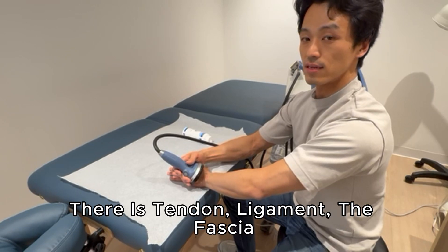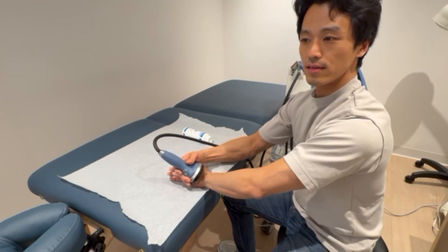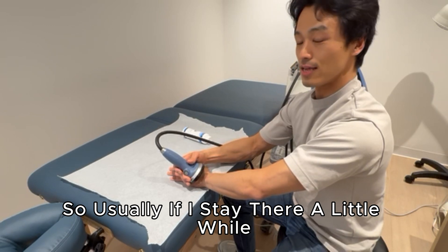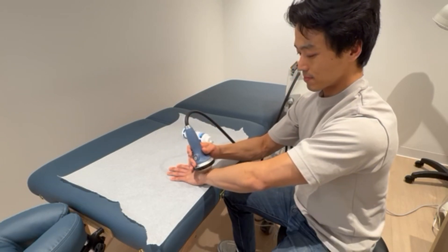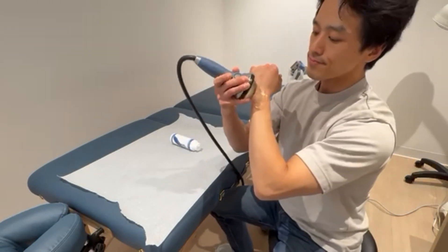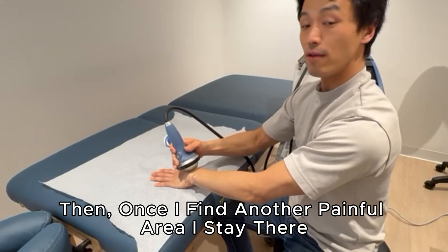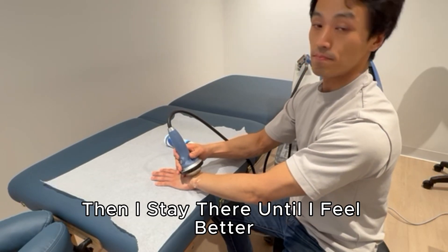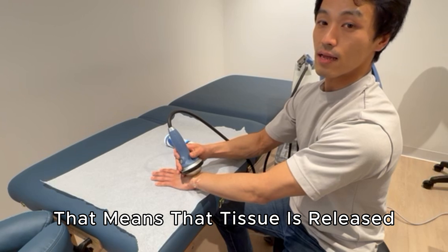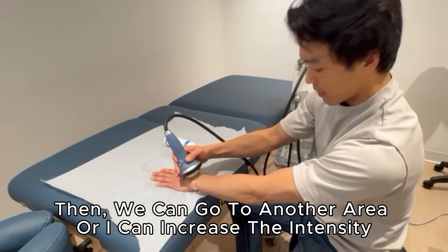Usually around the bone area there are tendons, ligaments, fascia, adhesion, trigger points, and scar tissue. If I stay over a painful spot for a little while, the pain decreases — that means the tissue is released. Then I search another area, find the next painful spot, stay there until it feels better, and move on. Once the tissue is released I can move to another place or increase the intensity.